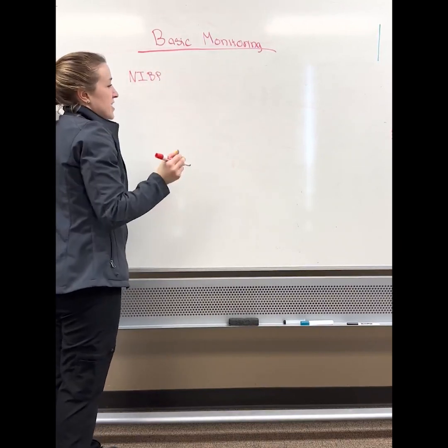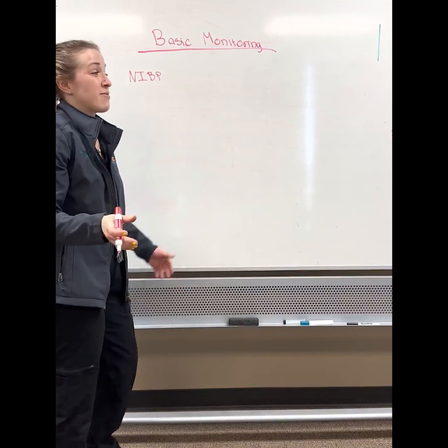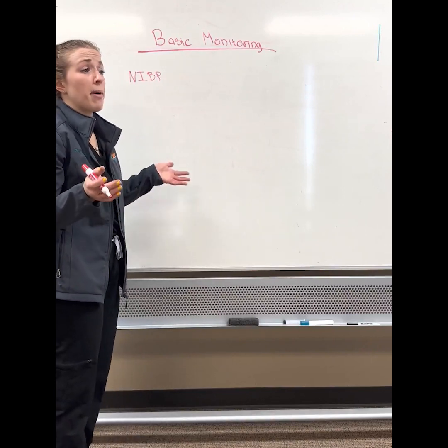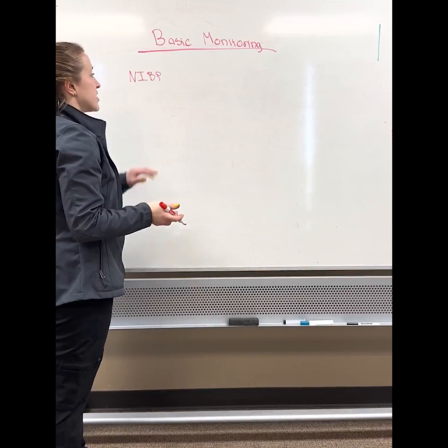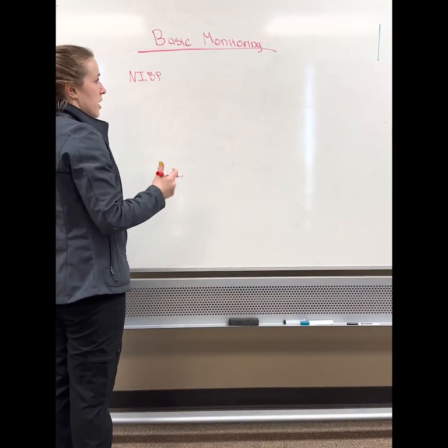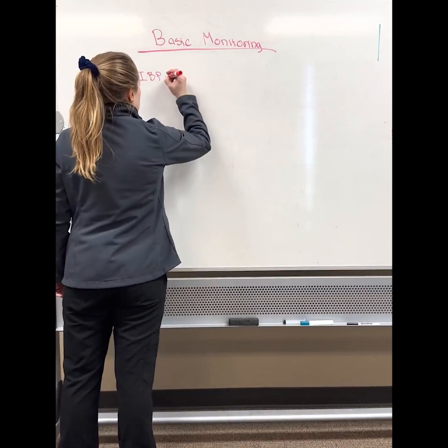One of my jobs as an anesthesiologist is to ensure oxygen delivery, and first you have to give oxygen to animals, and then you have to make sure that the heart is doing a good enough job pumping it to the tissues, because without that they die. So oxygen is very important, and the delivery of oxygen is very important, and blood pressure is one of the ways by which we accomplish that. So non-invasive blood pressure, that's a cuff measurement, okay? Cuff.